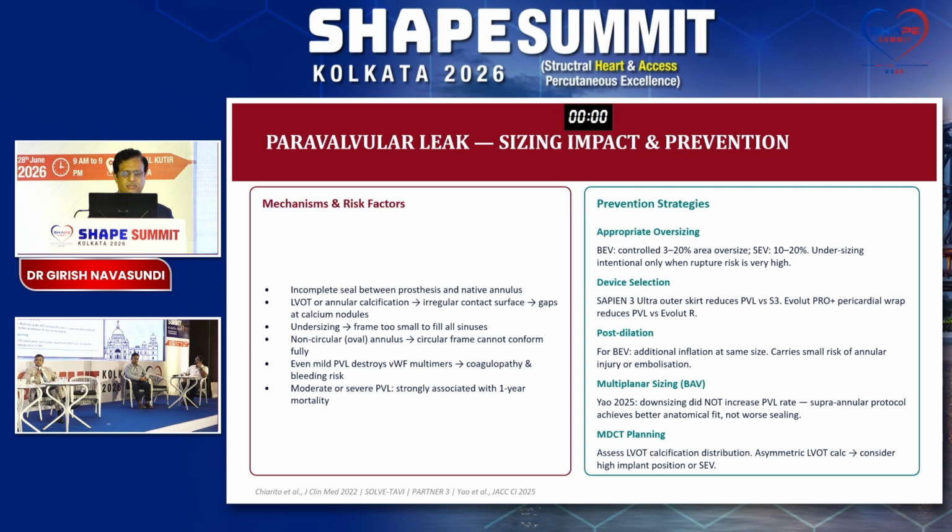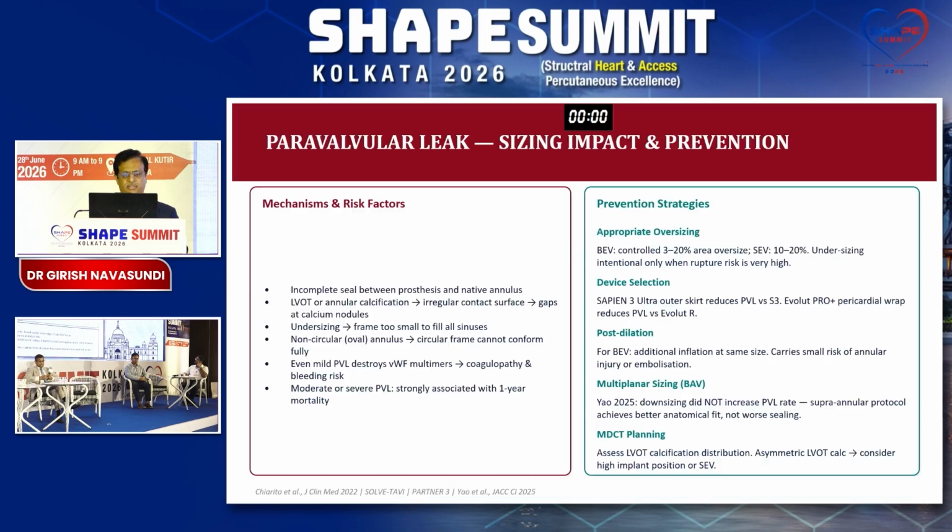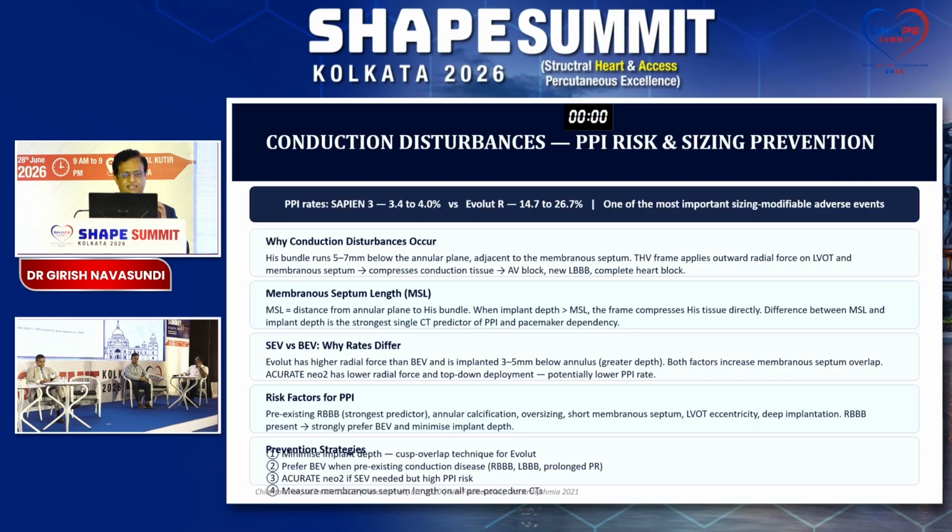There's a newer notion that the anchoring, the interaction between the device and the patient, does not happen at the annulus, but all through between the STJ and the LVOT. So you need to take multiple levels at the annulus, every 2 millimeters above and 2 millimeters below, and then very often the probability of downsizing the valve is about 90% of cases.